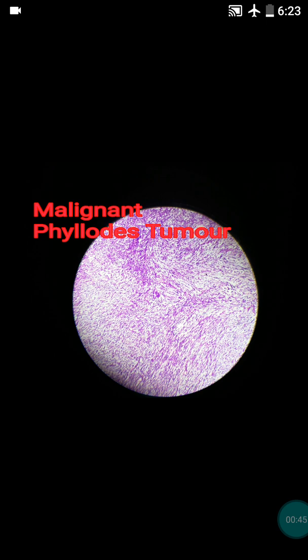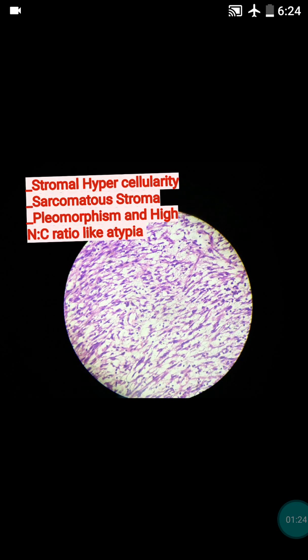This was a well-circumscribed 15 centimeter size growth received from the breast. The phyllodes tumor can be divided into benign, borderline, and malignant based on nuclear atypia, mitosis, and necrosis. In the malignant phyllodes tumor, there is greater than 10 mitoses per 10 high power fields, marked nuclear pleomorphism, marked atypia, and stromal hypercellularity.